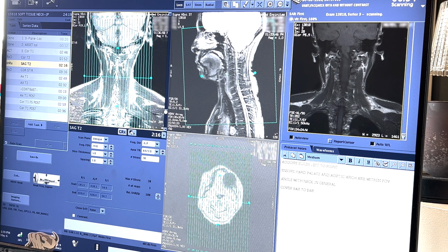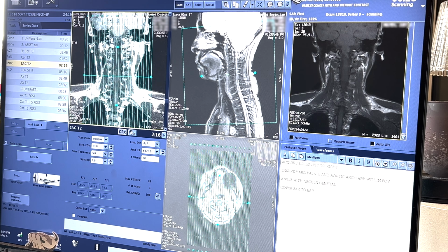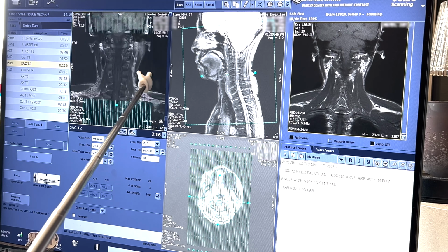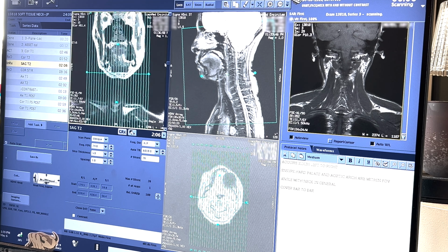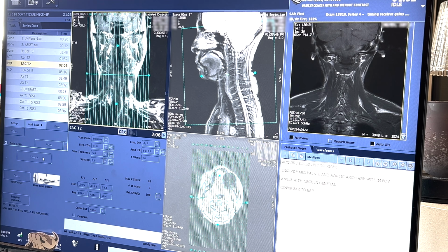There you go. And let's scroll the other way real quick. Keep going. Yeah, you go back down. I think we could cut 1, maybe even 2 right there, and on each side. You don't need the ears, so there you go. That's ear to ear, and then let's scroll one more time just to check. Right, that looks good. Now let's scroll down and shift to the left. That looks great. All right, this looks good. Let's save that. We'll move on to the axial plane.